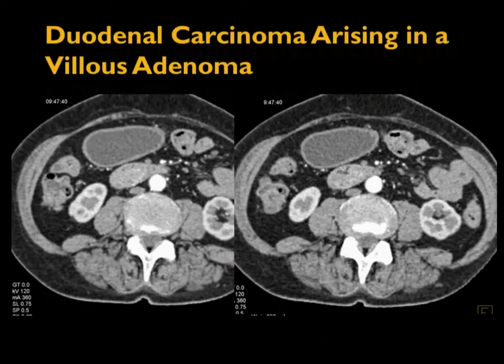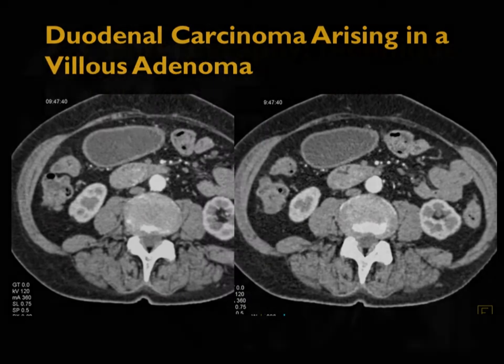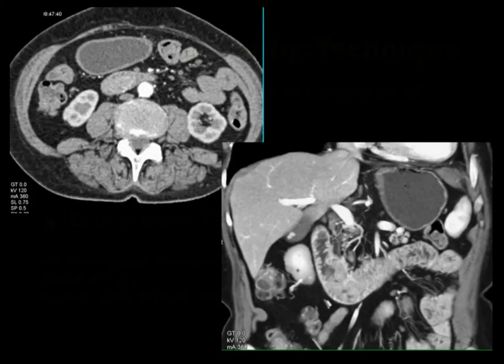Now, I mentioned before about the importance of looking at multiple planes. If you look at the axials here in this third portion of the duodenum, maybe you realize there's a bit more enhancement than usual, or perhaps the duodenum is a little thicker, but it's not that much different. Then what you might say is maybe it's normal. And you look at another slide. Is there something in the third portion of the duodenum? I don't know. But I tell you, when you look at the patient's coronal view, it becomes very obvious. Look at that tumor going from the second through fourth portion of the duodenum. The point that things are often easier to see outside the axial plane is really nicely defined here. And this was an adenocarcinoma.